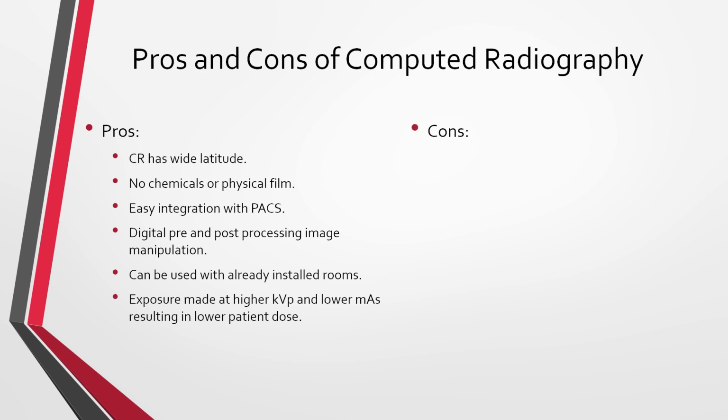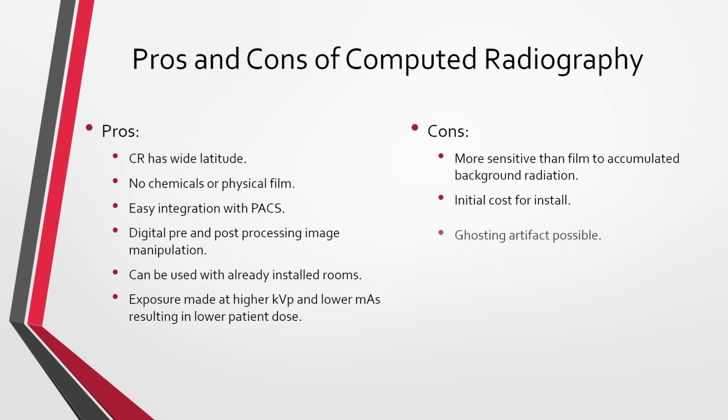Some cons of computed radiography are that it's more sensitive than film to accumulated background radiation. The initial cost to install and buy the equipment, compared to just keeping the film that a room may have.